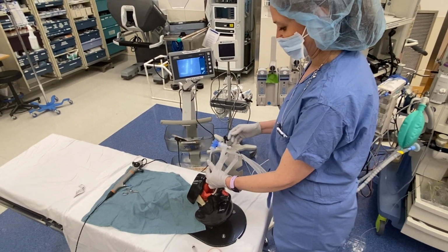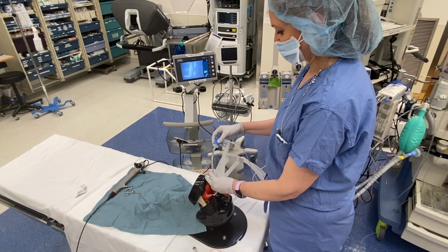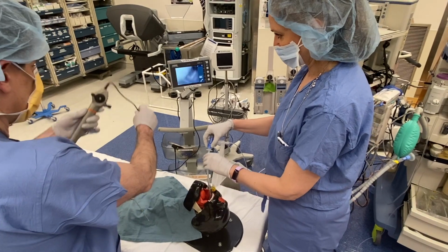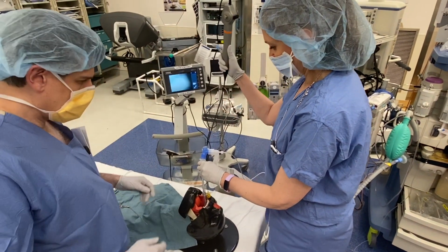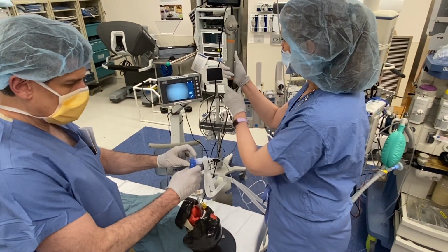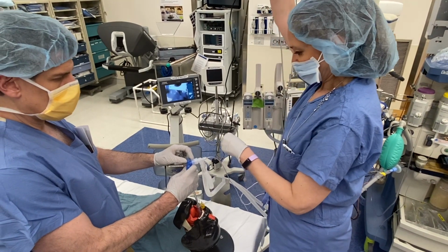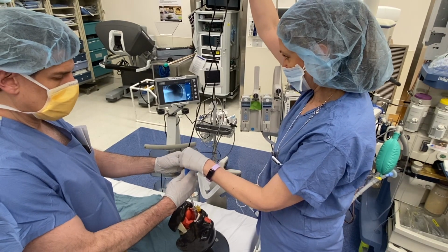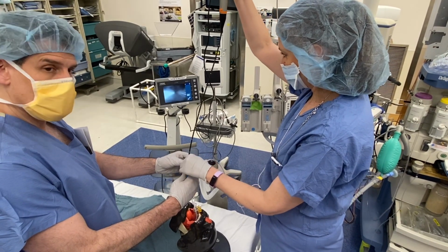At this point, we need to perform the flexible bronchoscopic intubation through the swivel adapter and ET tube. So Pete is going to hand Bistra this. It's a two-person technique, so you need somebody else to assist you. Bistra will pass the flexible bronchoscope in through the ET tube and down to the carina.